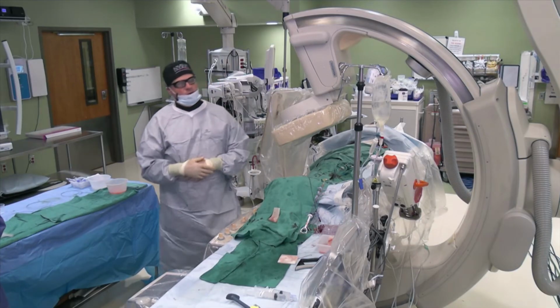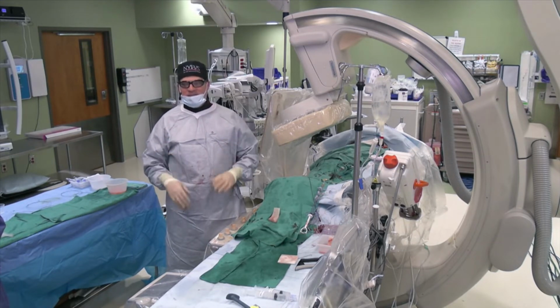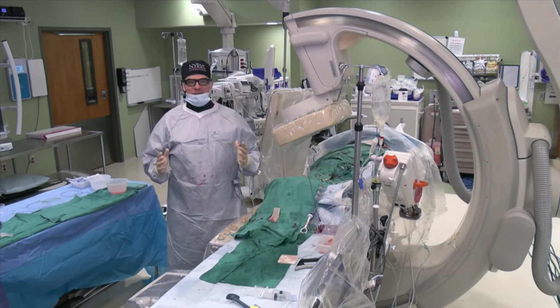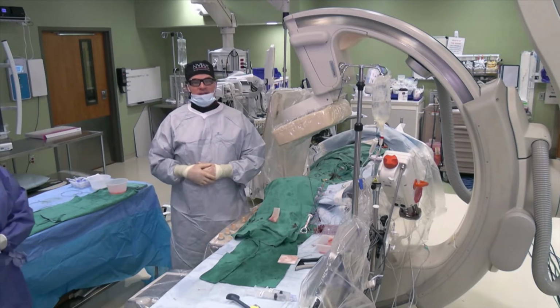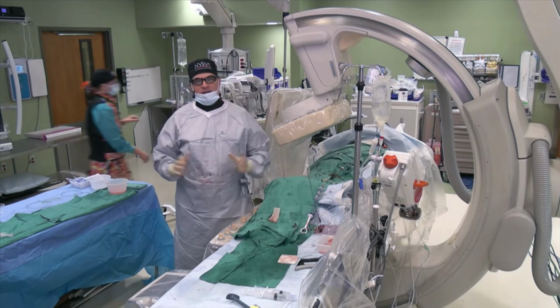Great. So listen, great case today. It's not necessarily in-stent restenosis. It may be a future in-stent restenosis once we cross this long chronic total occlusion. But I'm glad y'all are here to help me out with this. We have a great case.